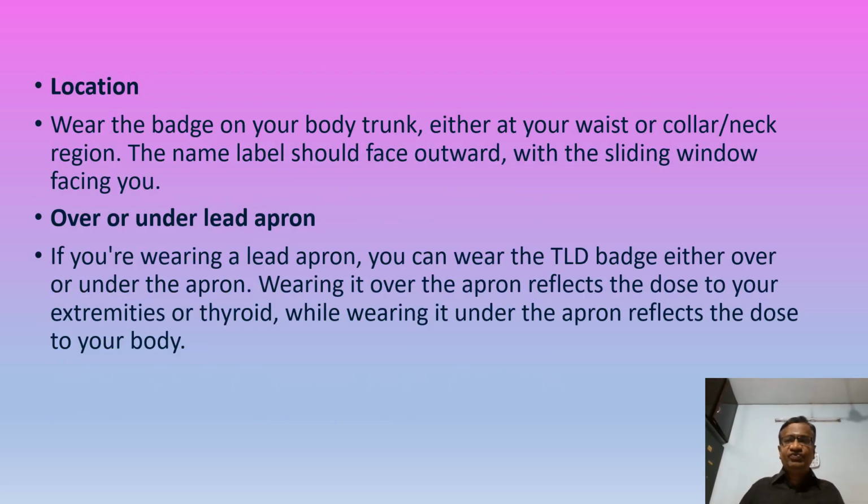On your body, trunk, waist or collar, the name label should face outwards. Okay, understand? With the sliding window facing you. It should not be the other way around. The name label should face outwards. Yes, Parthasarathy will be there. It should face outwards. There is a sliding window for the cassette. That should be on the other side. Okay. You can wear the badge either over or under your apron.